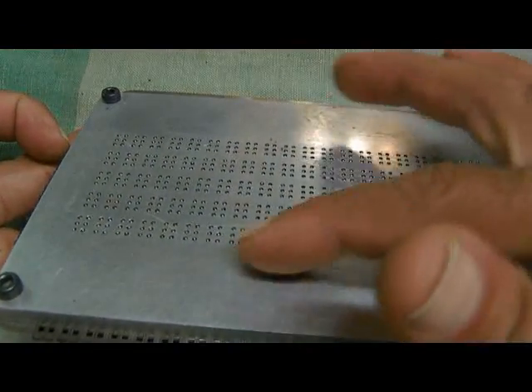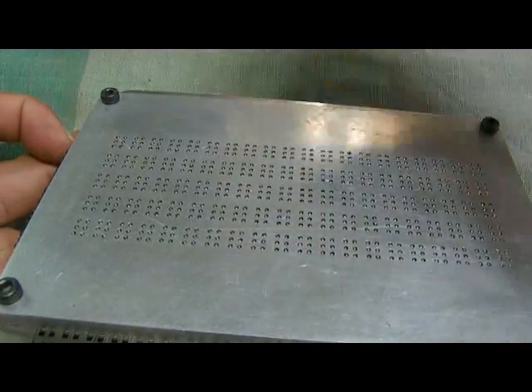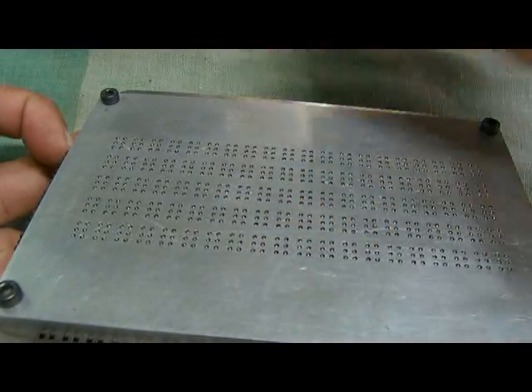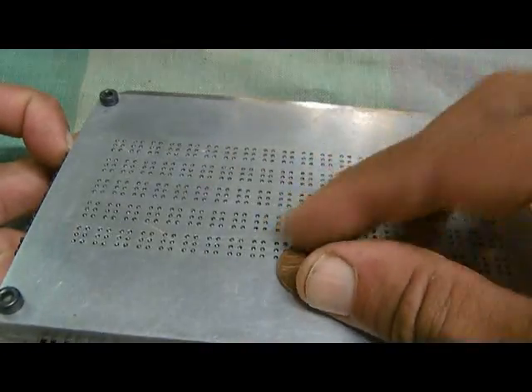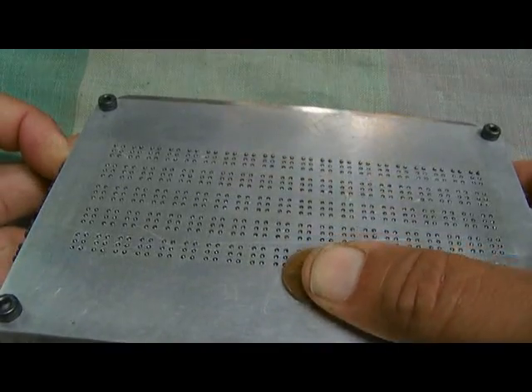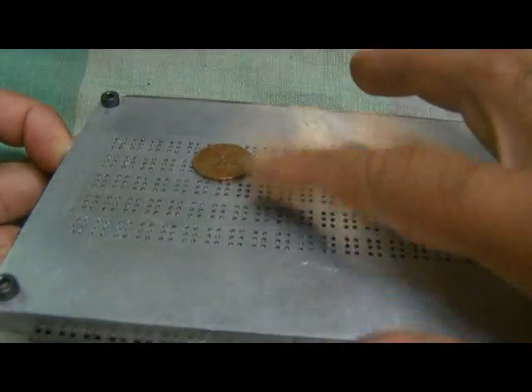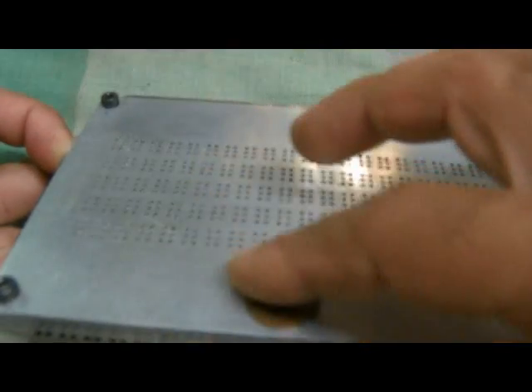Watch the penny drop. All the pins are basically down. Now I'll actuate this bottom row so that it kicks up the pins by 0.5 millimeter, and you can see that it's enough to stop the penny from sliding.